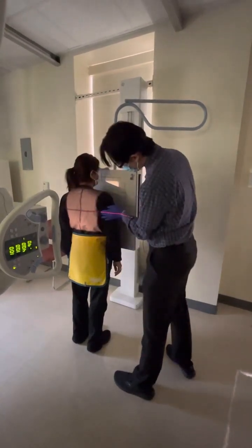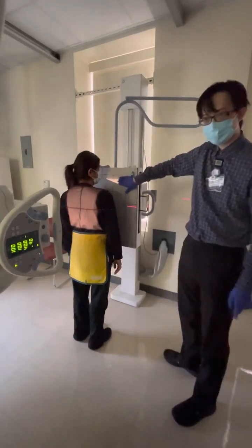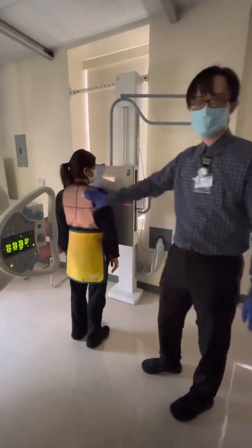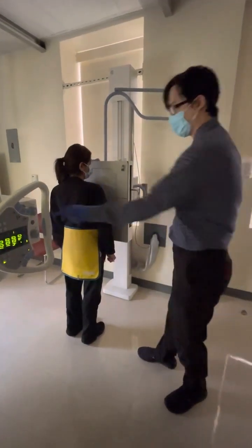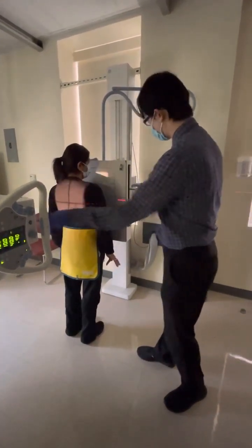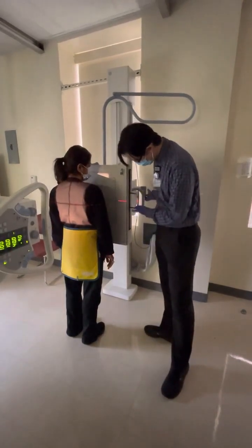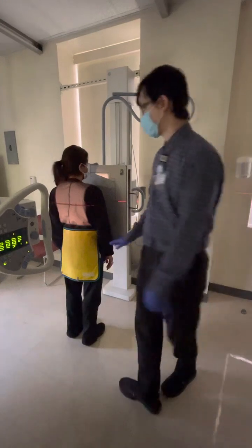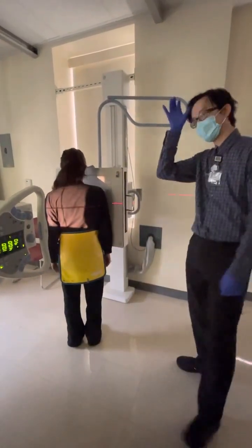Going to come over here, check the axilla. Come over here, 1.5 to 2 inches of light above the shoulders. So this height is good, right? Once we get that, then we can think about turning the patient. Of course, I'll also make sure to fix the IR. And so now we will turn our patient into an RAO.